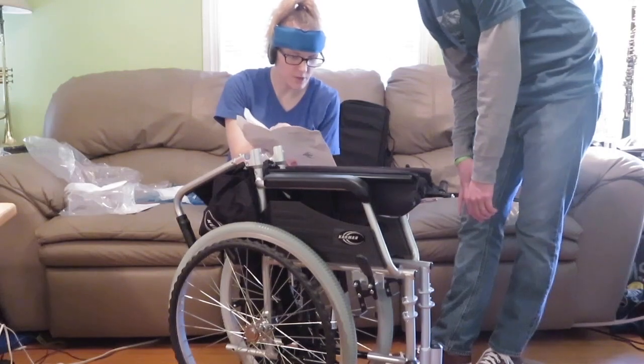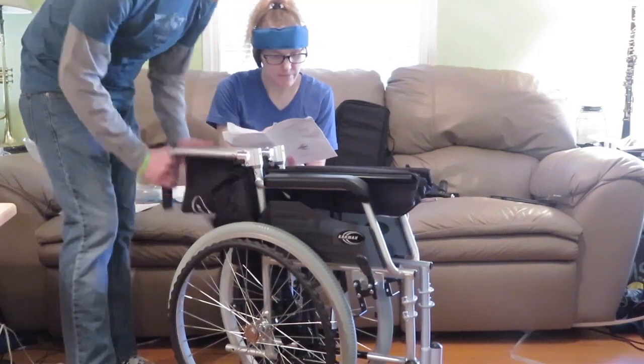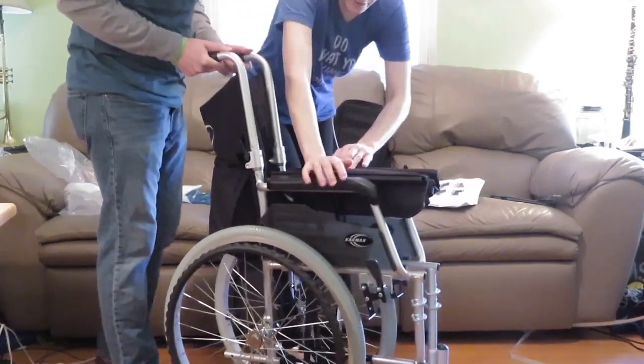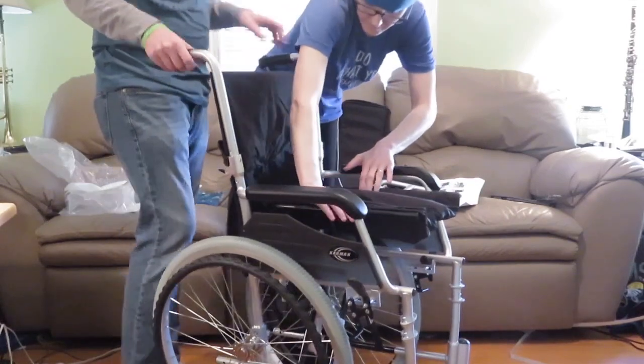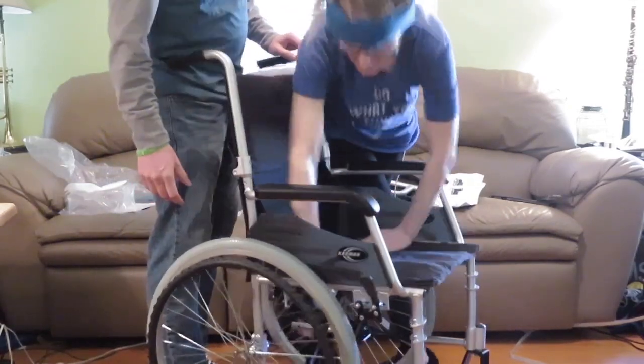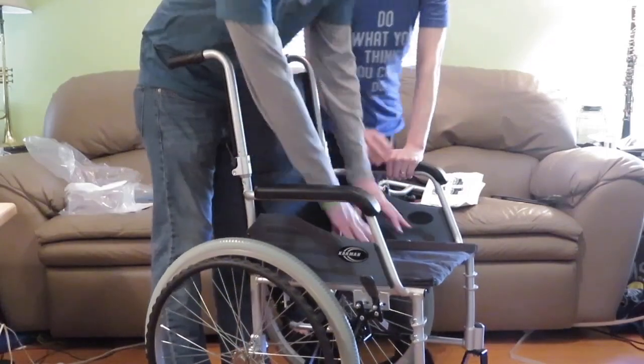So you do the handles first — push them up into an upright position — and then unfold by pressing down on both sides of the seat. Keep your hands on top. Kind of like the other one, these do snap into place. And it goes out like that. Pretty sturdy.